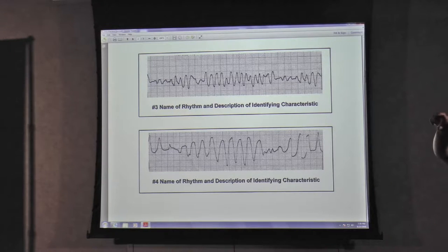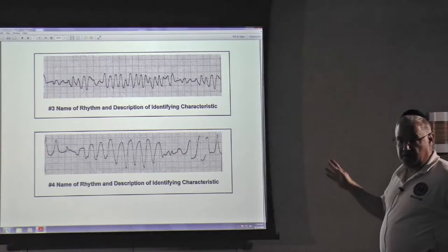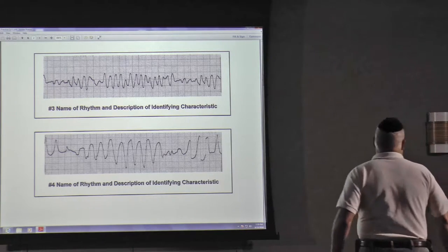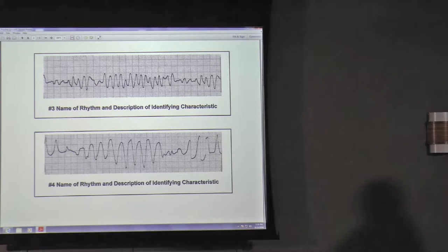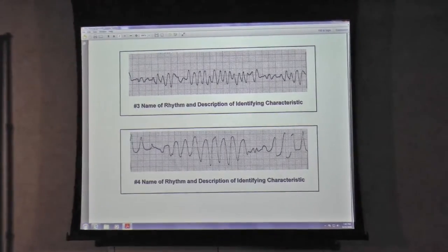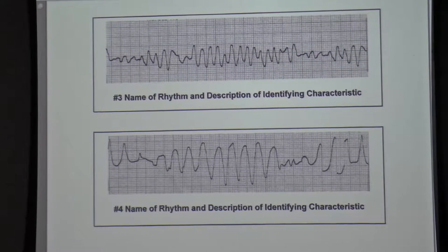And we said that fine V-fib untreated, or maybe unsuccessfully treated, would eventually go into asystole, right? So this would be somebody who may have coded in front of you or may have coded in the last minute or two. Okay, so a very fresh code. And we do have the ability, okay, on a BLS level to very rapidly intervene and probably save this patient's life with good effective CPR, okay, and the early application of the external AED. Hopefully, with a patient fresh like this, it should actually do what? We're going to defibrillate the heart and do what by defibrillating it? Stop it in the hopes that the normal pacemaker sites take over and put the patient back in a normal rhythm.